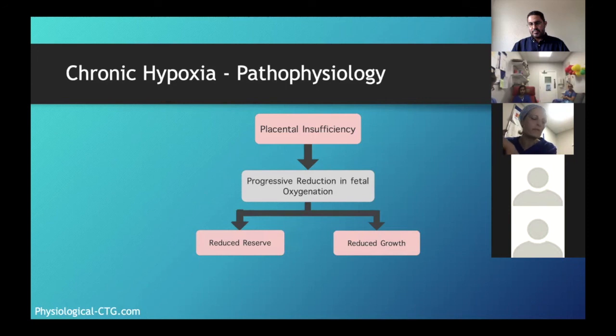Because Ahmed is very right to say, there's a bit of false negative for CTG, I'm speaking about antenatal CTG, with babies that are in the initial phases of chronic hypoxia. It means that they have very poor reserve, but they are not showing yet the chronic hypoxia typical signs on the CTG. Because when you have chronic hypoxia on the CTG, you know that that baby's not going to cope.